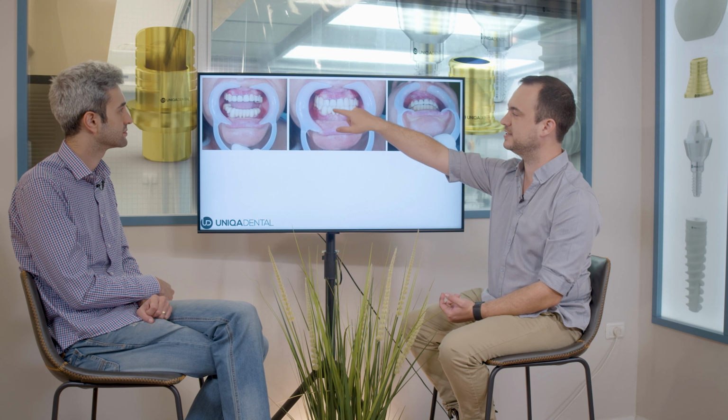And adding to all of that, you can see the aesthetics are not perfect. You can see that the height of the canines is different, the height of the central incisors, and that the second incisors are different sizes. It's a porcelain bridge? Yeah, it's a PFM bridge. You can see that the central line is not perfectly aligned.